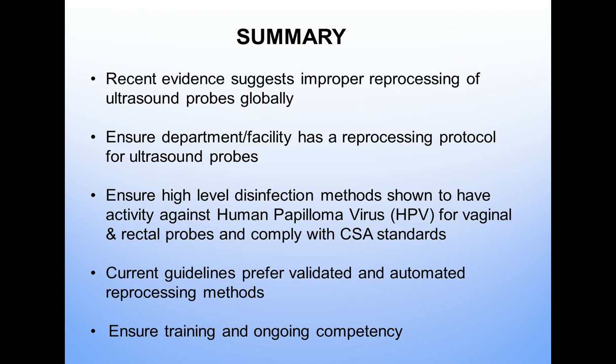For many years, and we still do, and we will for years to come, perform manual cleaning and disinfection methods. However, anytime you have a manual method, then you have a risk for errors. We're humans. There's a human factor that comes into play there. And as I said, nobody ever comes to work with the intention of missing out on a few steps or making errors.